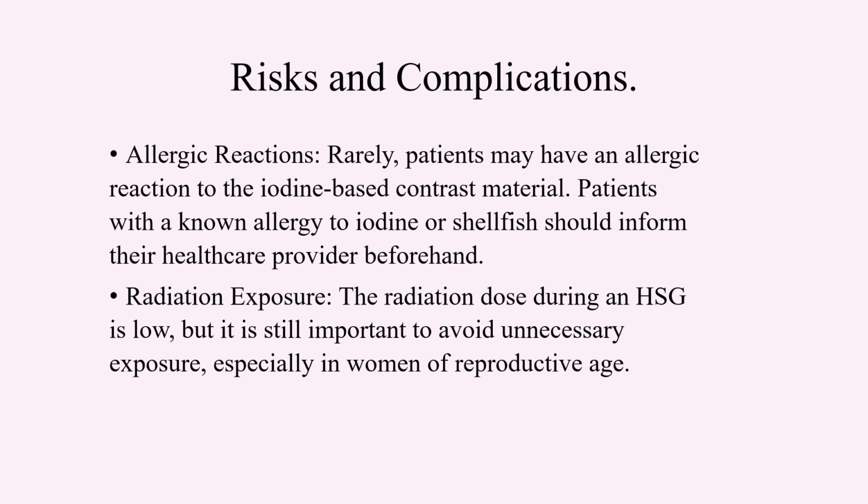Other complications include the chances of allergic reaction to iodine-based contrast materials. Radiation exposure is also present, but it is important to avoid unnecessary exposure, especially in women of reproductive age.